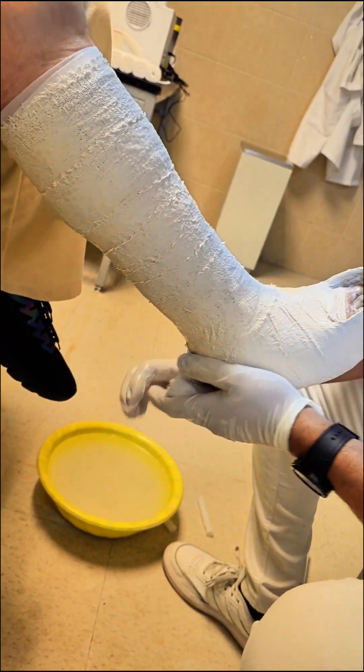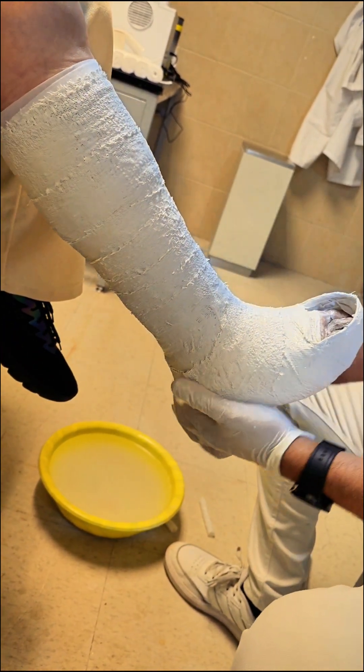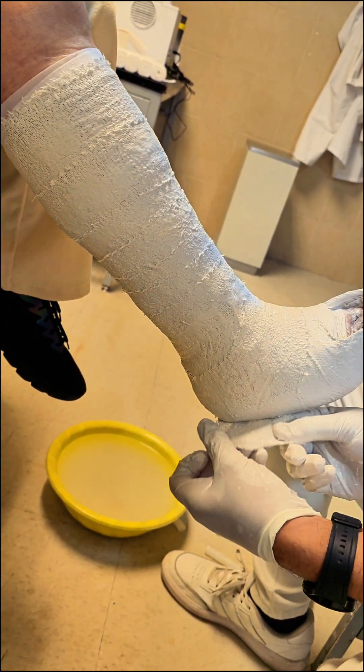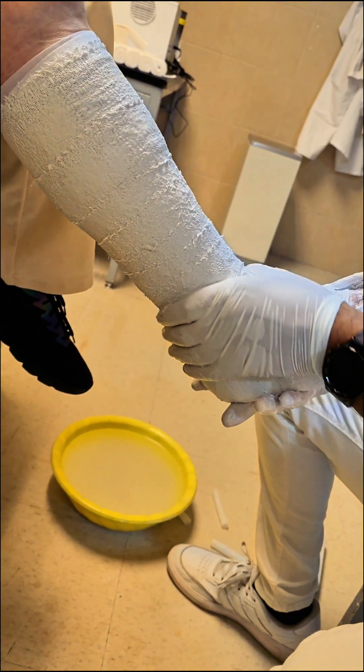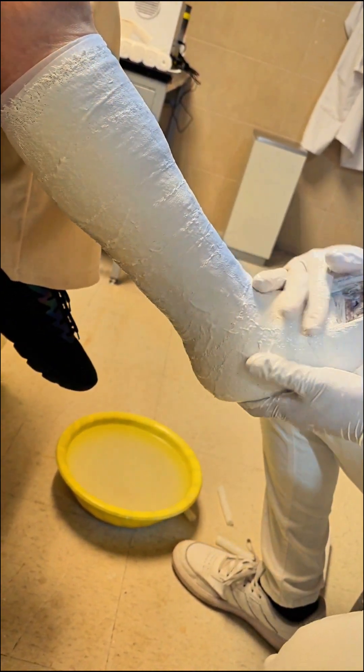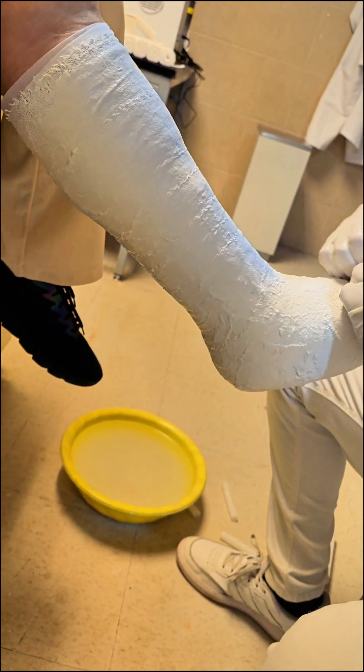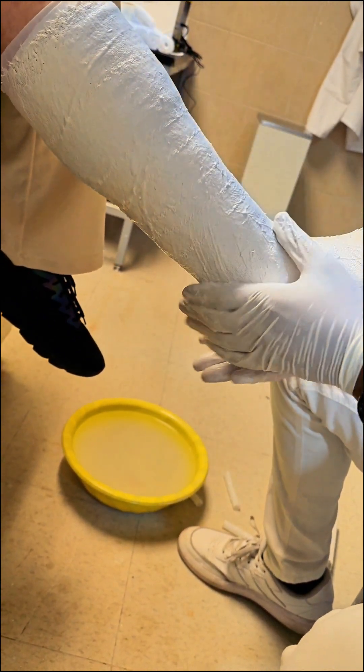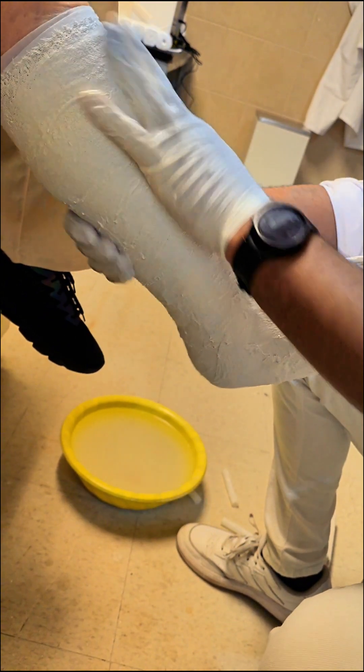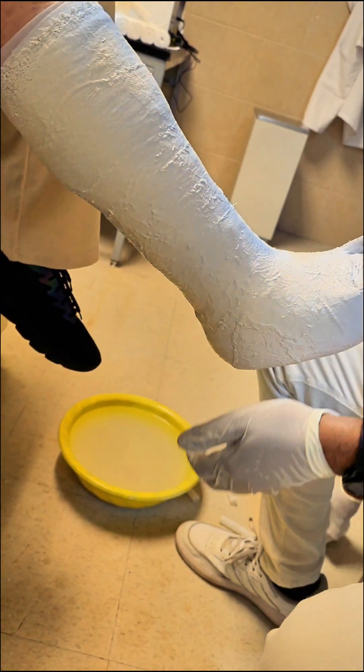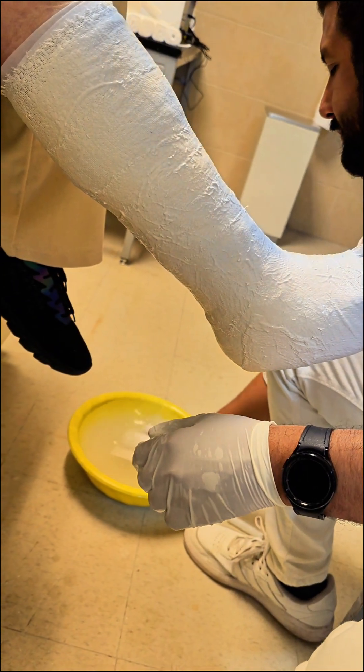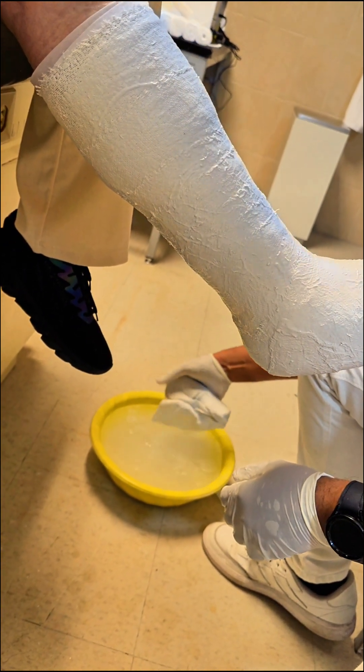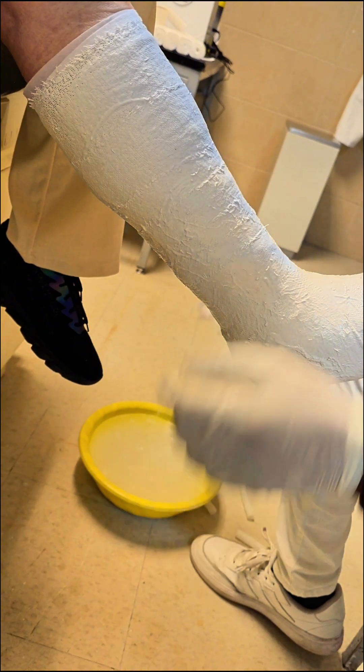The Swedish shoe cast is the most robust of the three, often used for severe fractures that require full immobilization. Here's how you apply it. One: initial positioning. Position the foot at a slightly relaxed angle rather than the strict 90 degrees used in the other casts. This slight relaxation helps accommodate swelling and ensures comfort. Two: padding. Because this cast is more restrictive, generous padding is crucial. Pay extra attention to the heel, ankle, and lower leg to prevent pressure sores.